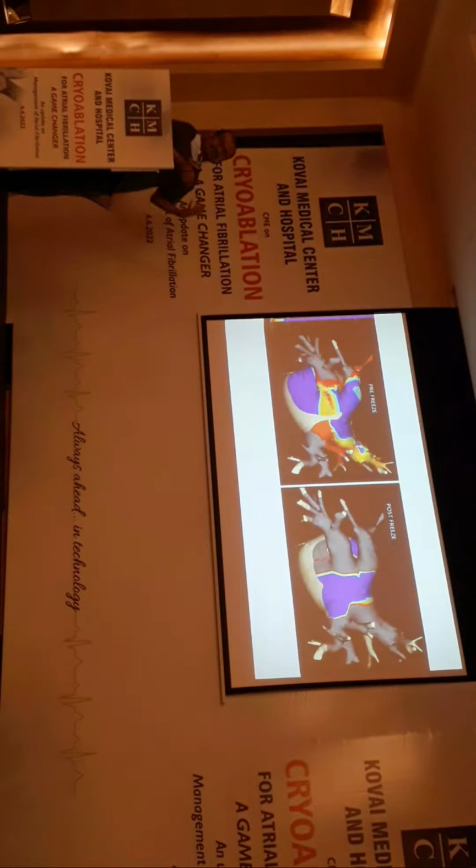But because the cryoballoon delivers larger lesions, you can see a larger area of the posterior wall of the left atrium is already isolated. We know very well from our experience that most of the substrate for persistent AF also remains in this area. So when you are able to do a PVI with a cryoballoon, you tend to take care of some amount of substrate in the posterior wall of the LA also. This is one reason pulmonary vein isolation by cryoablation has an effect which is more than what you expect from doing a pulmonary vein isolation.